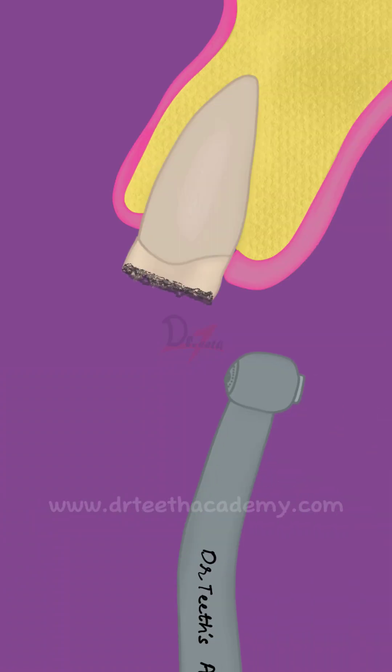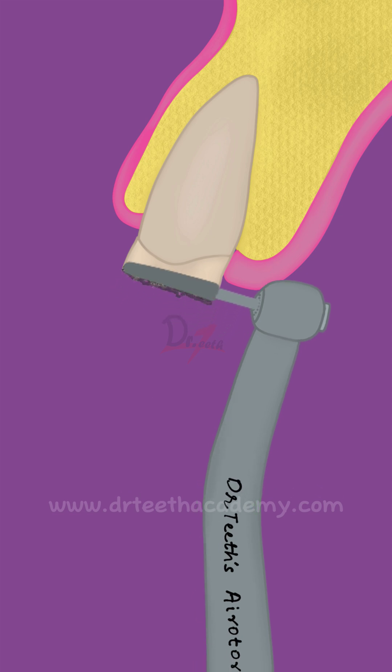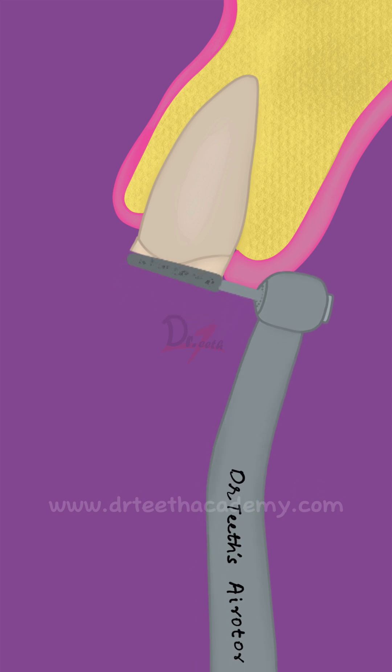Assalamu alaikum. Let's learn about the socket shield technique. First of all, we'll numb the tooth and then we are going to give a horizontal cut.